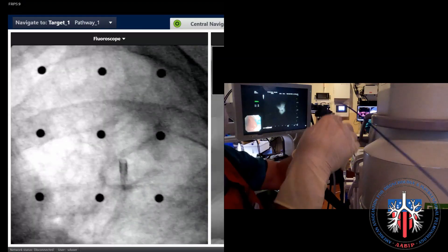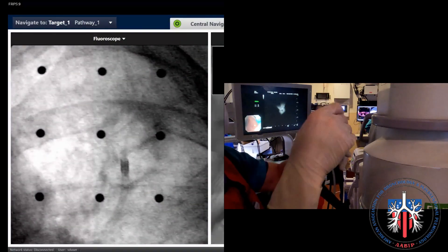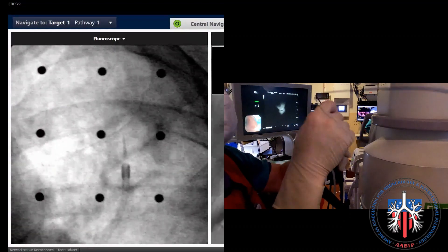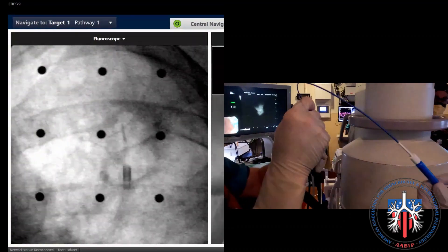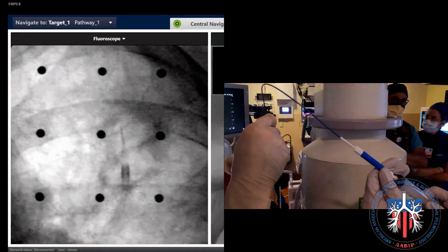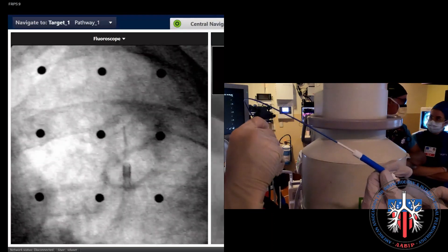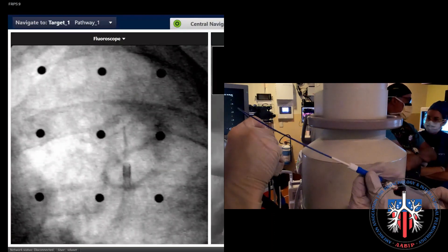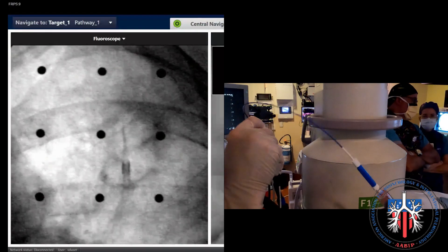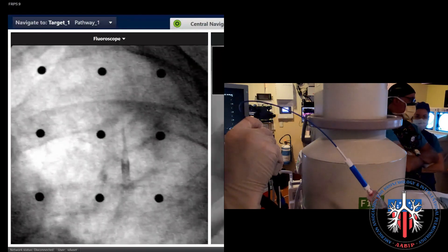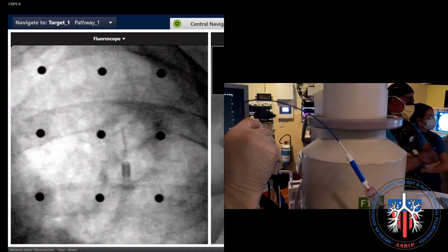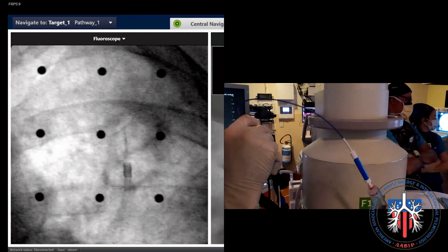Pass the transbronchial needle until it aligns with the edge of the navigation catheter, and then ask your assistant to extend the needle into the lesion. Agitate the needle multiple times, roughly 5 to 10, then withdraw the needle and remove it from the field.